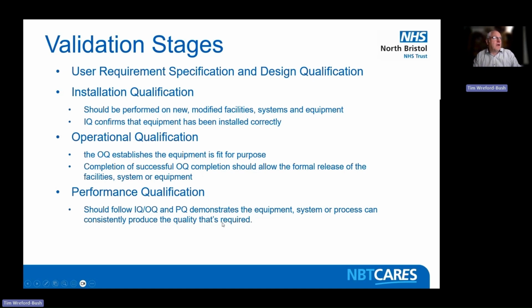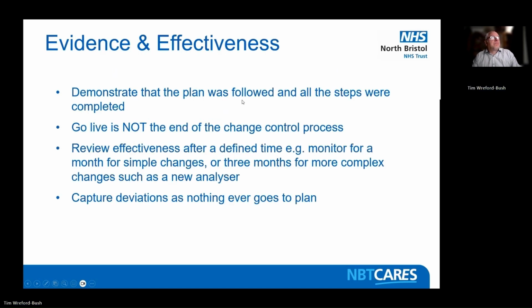And then you've got performance qualification, which should follow your IQ and OQ. PQ demonstrates the equipment, system, or process can consistently produce the quality that's required. You don't necessarily have to do it in that order, but that's how it normally goes. So, the evidence and effectiveness.